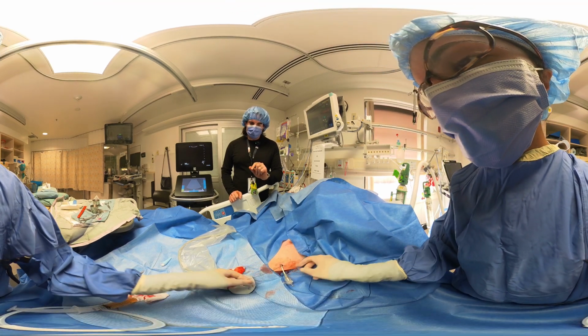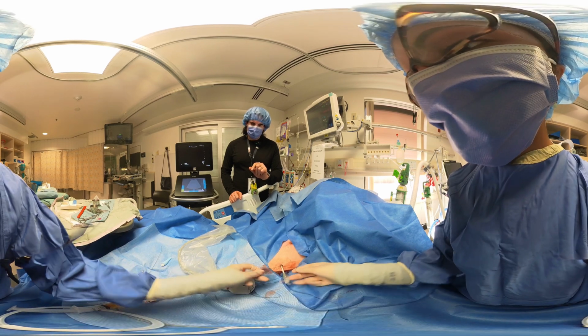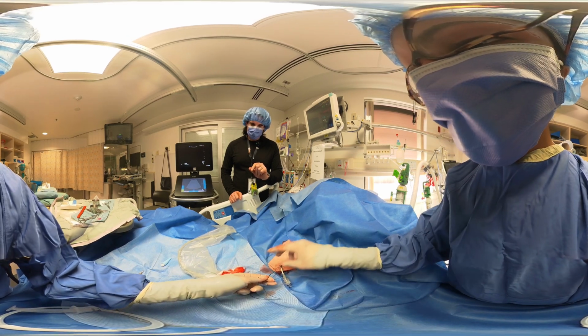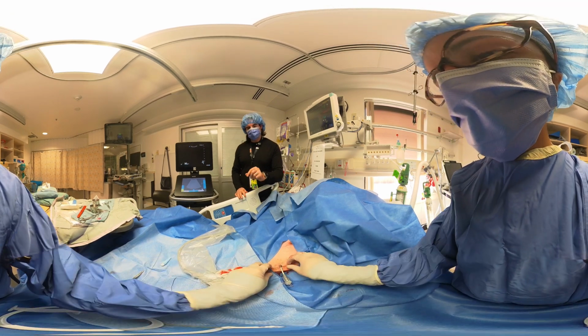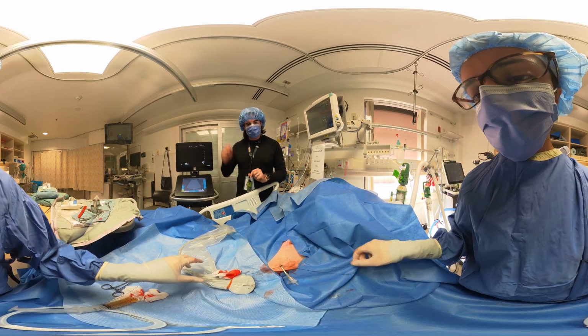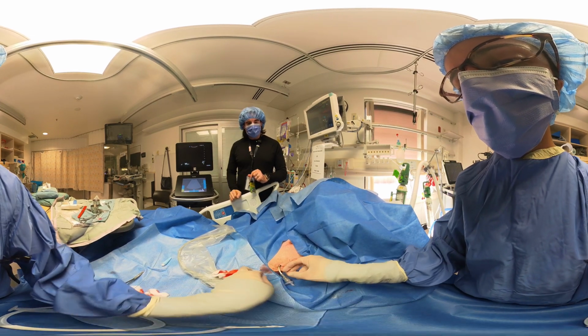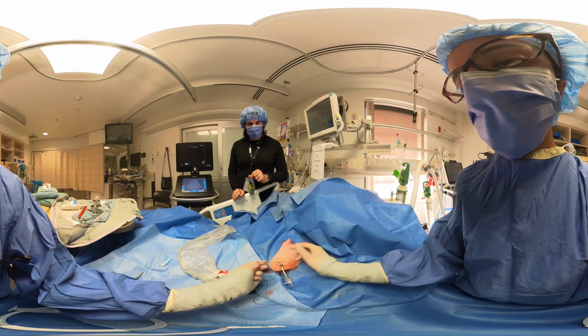Okay, now throw a second knot down. Just a regular knot, yeah. I forgot how to do it. You're so close. Hold on. Great. Awesome. Okay, we'll throw down a few more knots here and make sure it's super secure, and then we're pretty much ready to attach to the thoracic drainage device.